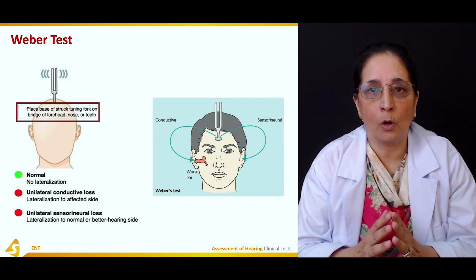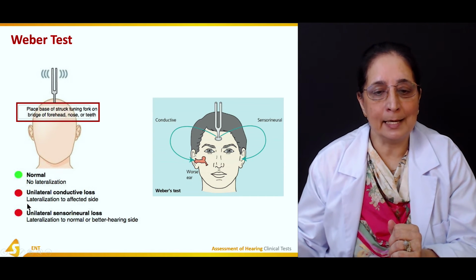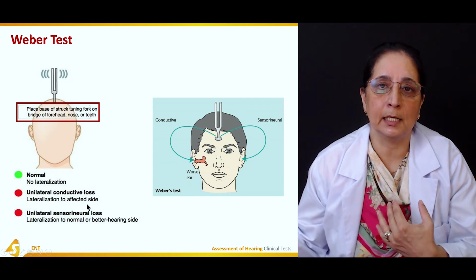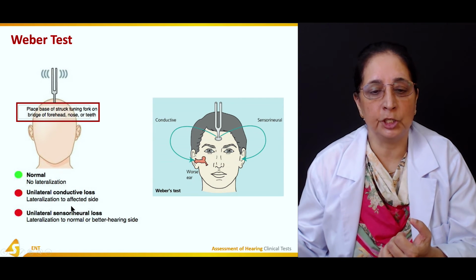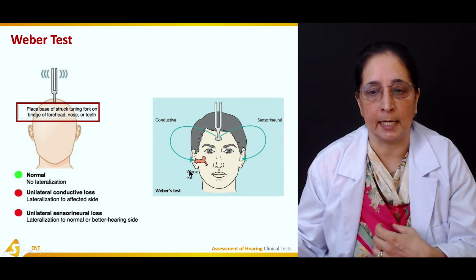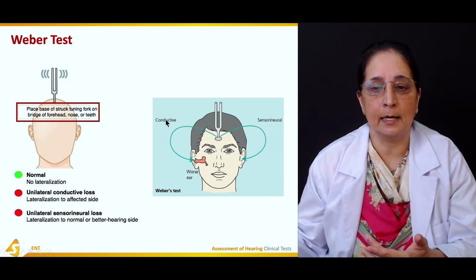That's the normal response. In unilateral conductive loss, there is lateralization to the affected side. Lateralization to the affected side, that's conductive.